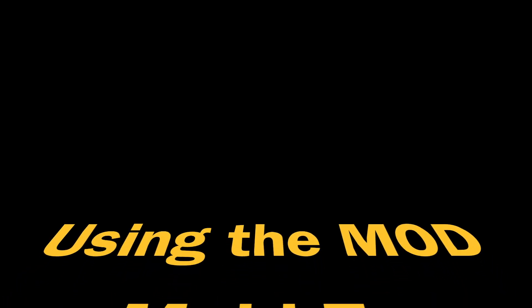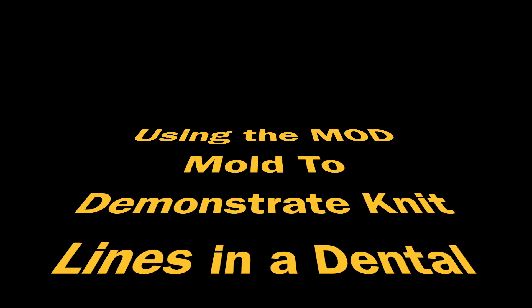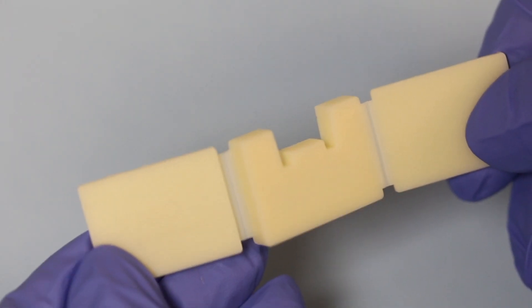In a previous video, I showed how Ultradent has produced a mould that can be used to demonstrate the effect of different curing lights on different composites. This mould can also be used to demonstrate the effect of different filling techniques.